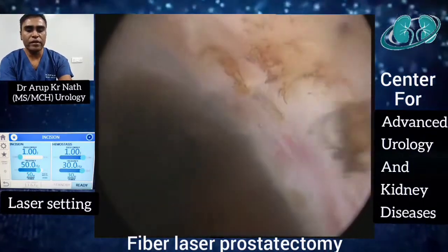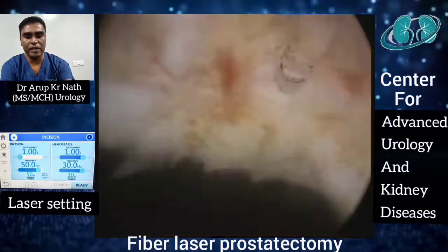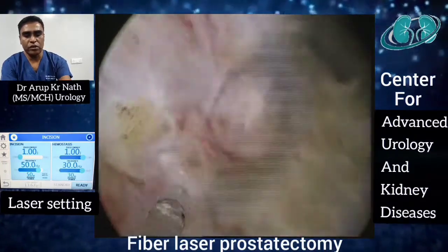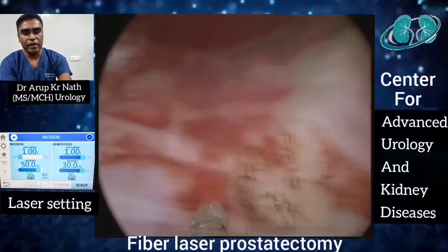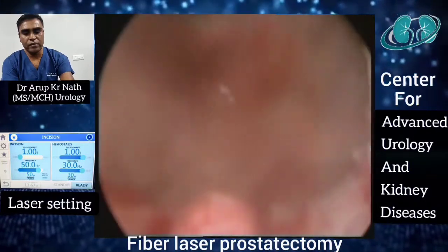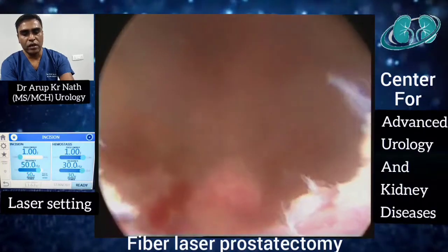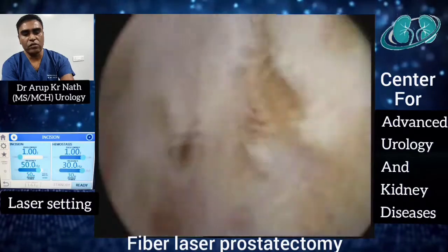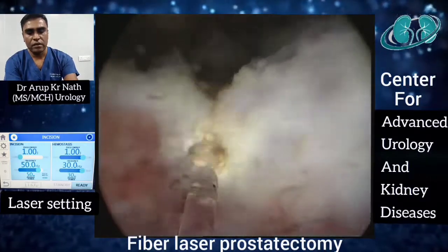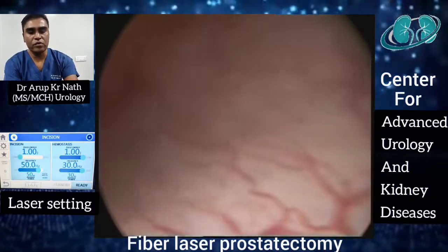At this moment we have a quick round of the prostatic fossa again to check for any pinpoint bleeding vessel, and we can activate the laser on hemostatic mode so that it can be immediately taken care of. You can see the verumontanum, which is the distal limit at the apex level. There is no bleeding visible at this moment. We conclude the procedure by making a small bladder neck incision — this can be avoided if the bladder neck is not too elevated, but here it was elevated so a small incision was made.